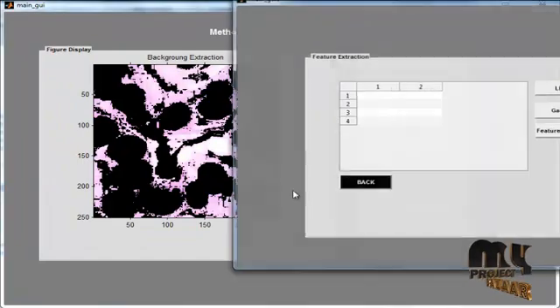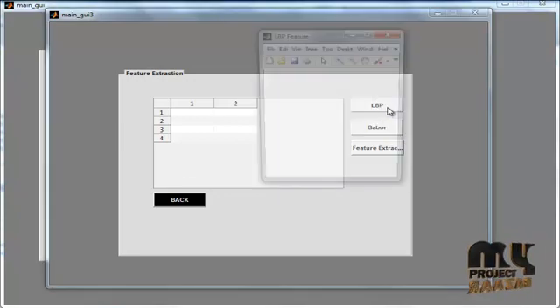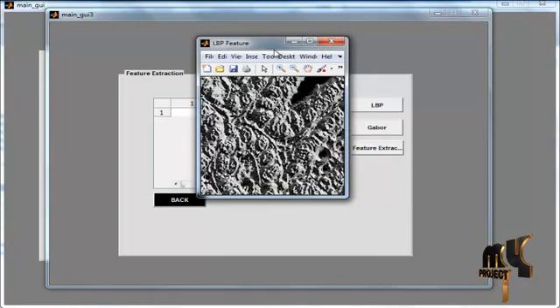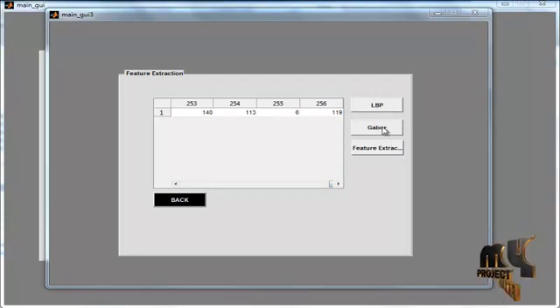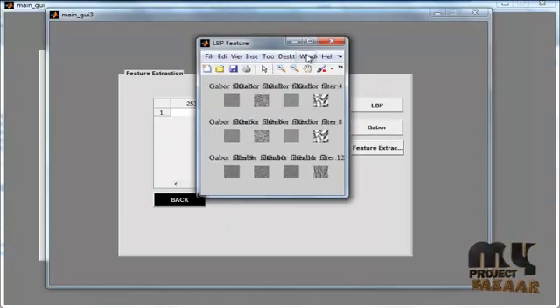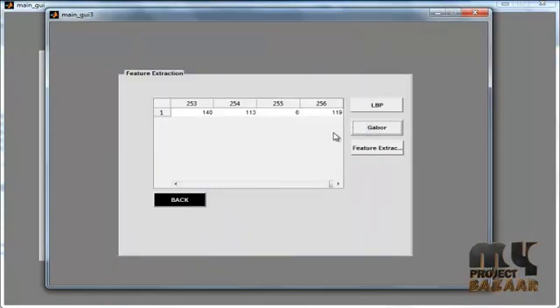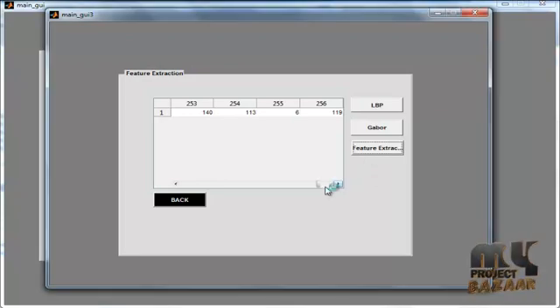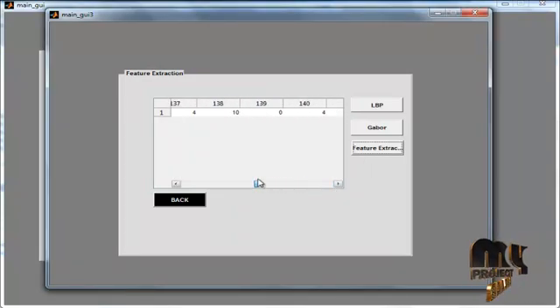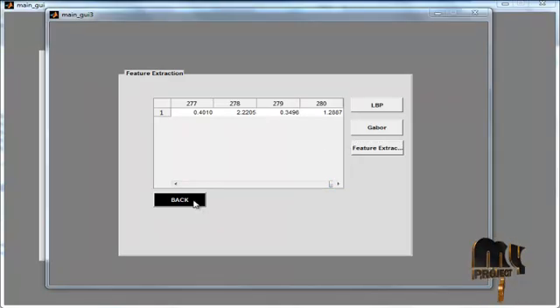Now, feature extraction is carried out by clicking the Feature Extraction button. Here we can see two different feature extraction methods: LBP and Gabor. By clicking the LBP button, we can view the LBP image and extract features using the LBP feature extraction method. Then click the Gabor button for Gabor feature extraction. There are 12 iterations for the Gabor feature extraction process. After extracting the Gabor feature, it is saved as a .mat file. After clicking the Feature Extraction button, the Gabor feature along with the LBP feature is stored as a .mat file, and the combined values are shown in the UI table.